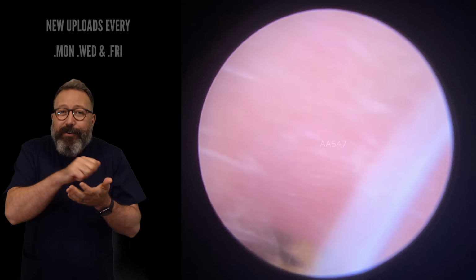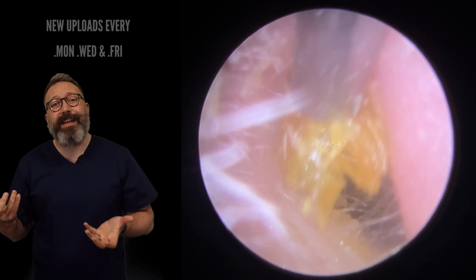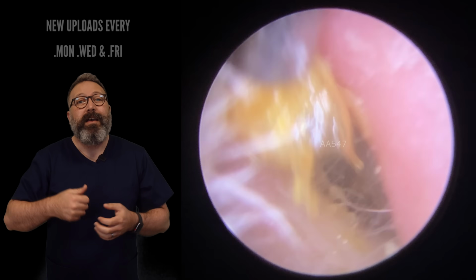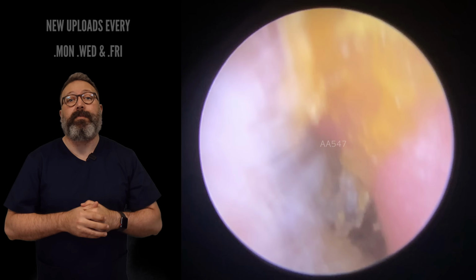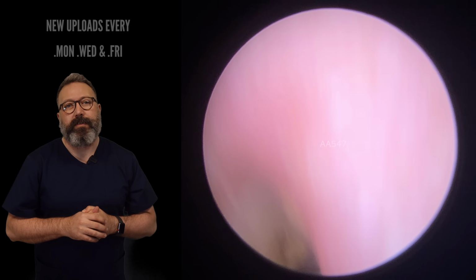Now, I know it looks quite aggressive when we move to the wiggle on the outside edge, but don't forget this is dead skin, it's come away. The patient doesn't feel anything apart from a little bit of movement in the ear canal. So we're just drawing this next section down. Look at this long strip you can see coming away there. There we go. Out, look at that come away, that's really good.